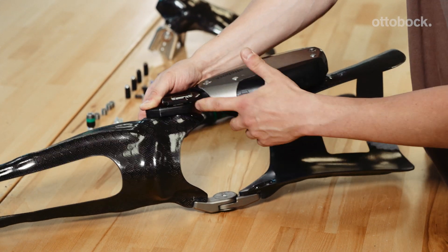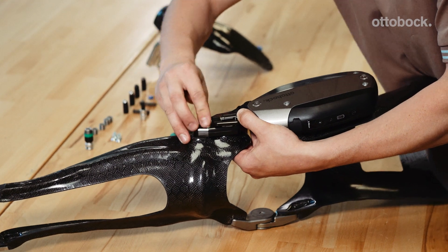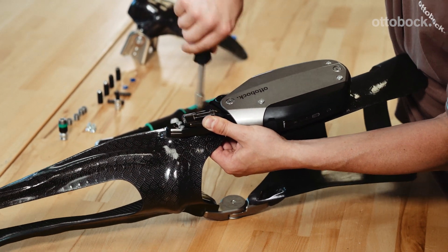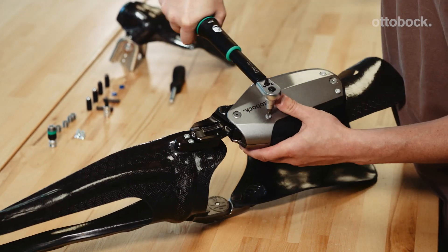If you unscrew the joint unit from the orthosis, for example for servicing purposes, all anchor nuts have to be cleaned afterwards. Make sure that there is no leftover Loctite 241 residue in the thread before you screw the joint unit back on and secure it with a torque wrench and Loctite.